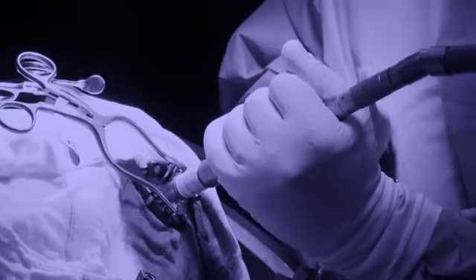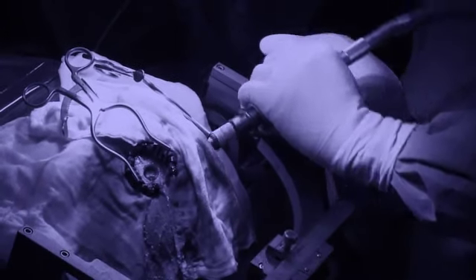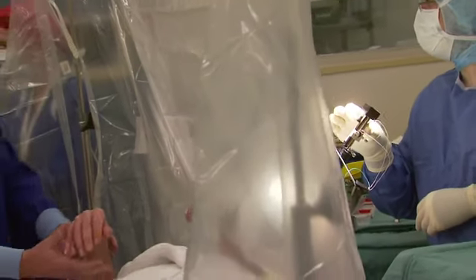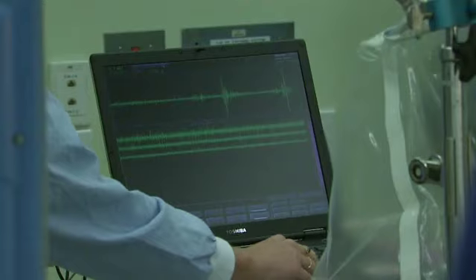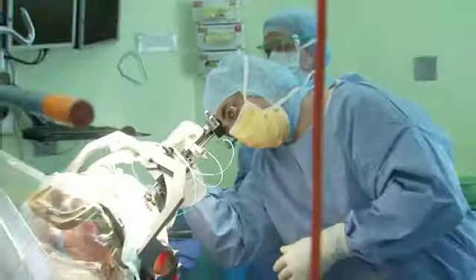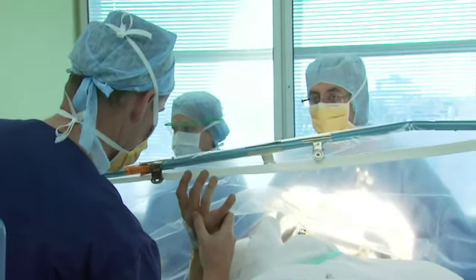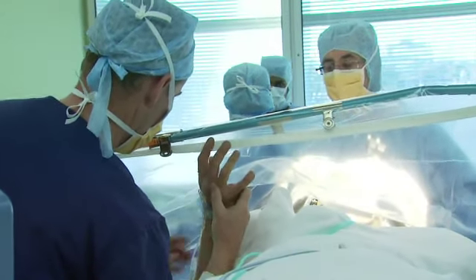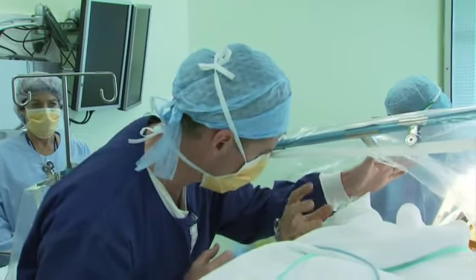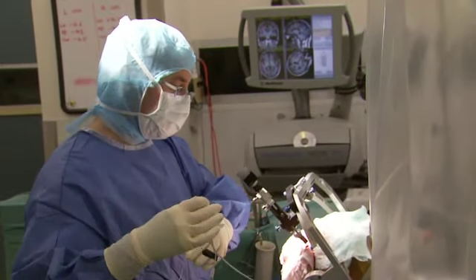I make an incision — two holes if we're doing both sides, or one hole if we're just doing one side of the brain. We use very specialized pieces of equipment to allow us to record signals from the brain and to stimulate the brain as we're passing a fine wire down to the proposed target. We can often spend an hour or even several hours getting this right, making sure that we know exactly where we are and where the best spot is to put the electrode.